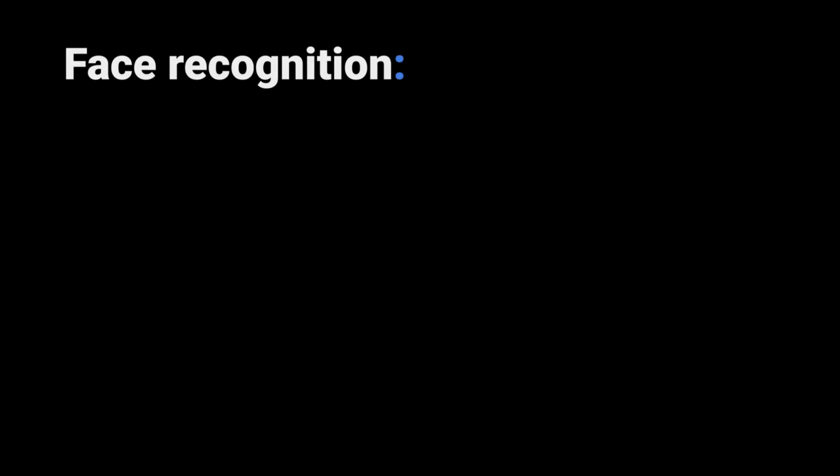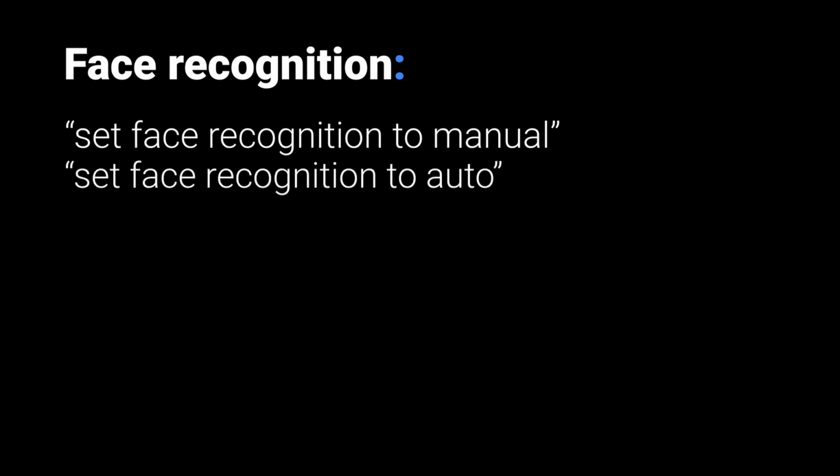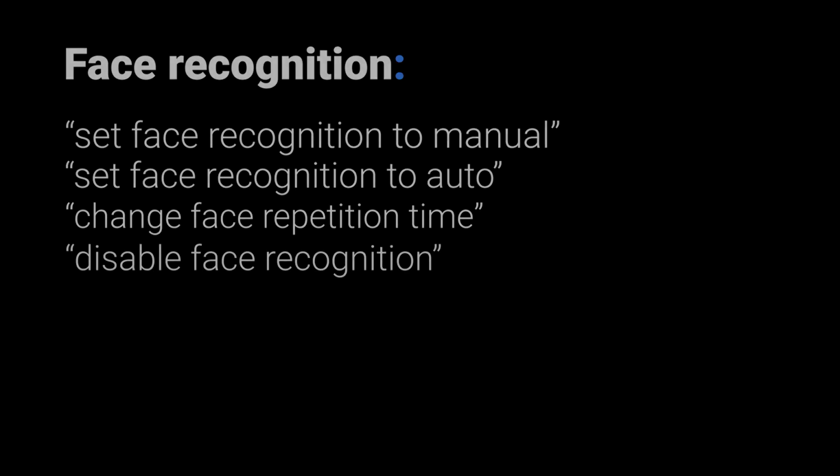Face recognition for MyEye only. Set face recognition to manual. Set face recognition to auto. Change face repetition time. Disable face recognition.